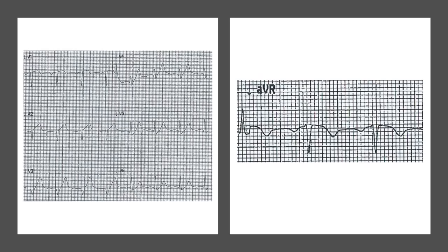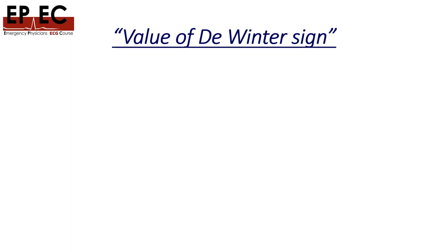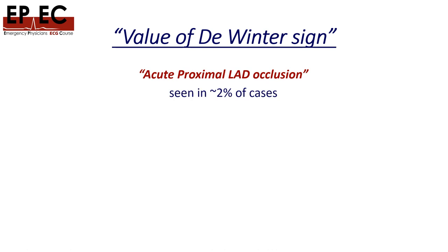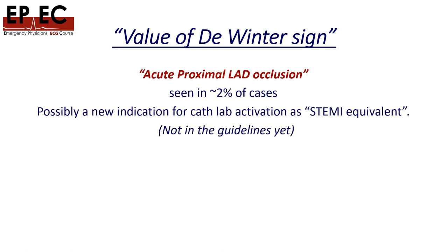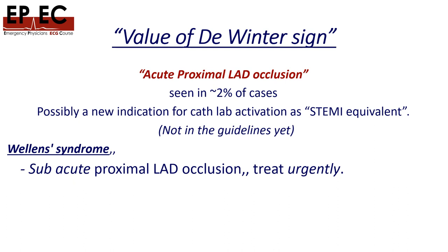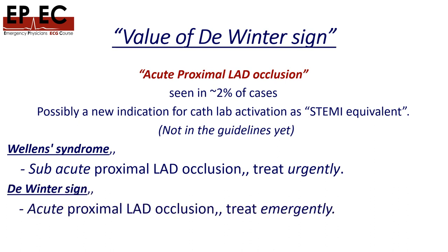In our patient, we can see the ST elevation in AVR and the poor R wave progression. The De Winter sign is a sign of acute proximal LAD occlusion — it is that serious. It's been seen in about 2% of cases with LAD occlusion. It is possibly a new indication for cath lab activation as a STEMI equivalent, though to my knowledge it is not yet in any guidelines. If comparing to Wellens syndrome: Wellens is a subacute proximal LAD occlusion treated urgently, while De Winter is acute and should be treated emergently.